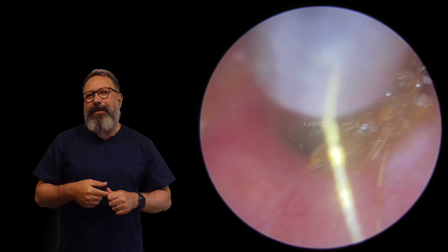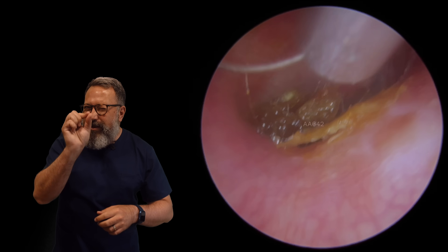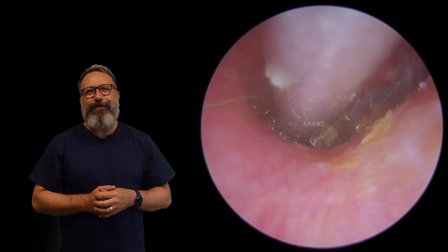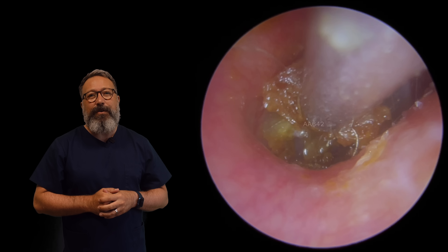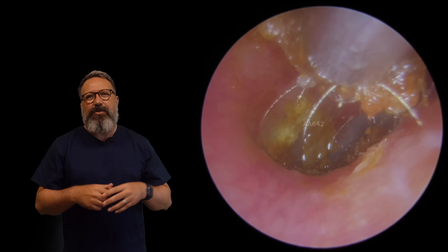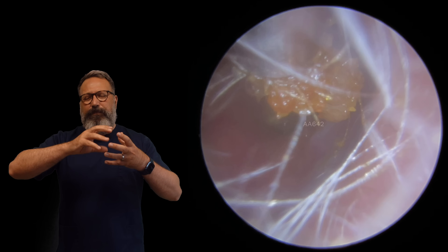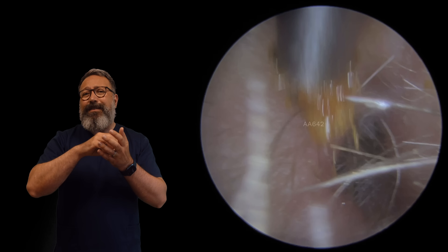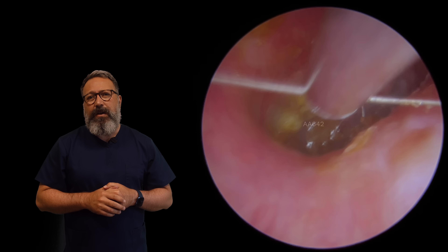We've got a bit of a change coming next week — I've altered things up just a smidge. I'm not going to say anything, I'll just let it run and we'll see how it comes out for you. So we've just got these last couple of pieces — there we go, coming away. That's the last of the sort of bigger chunks of wax, but if you look just beyond them you can see the eardrum — there's a creamy brown colour right at the bottom of the drum, little bits stuck there. We're going to go back in with the fine end for those.